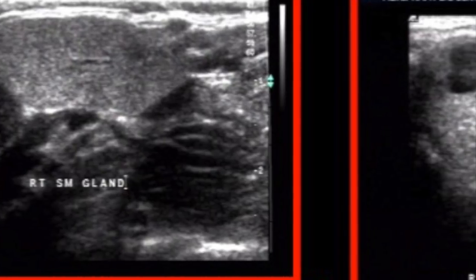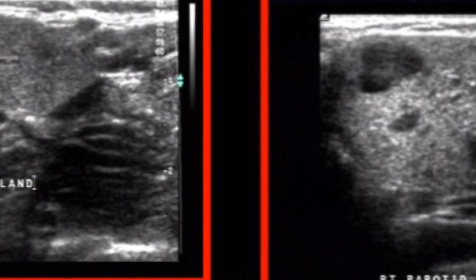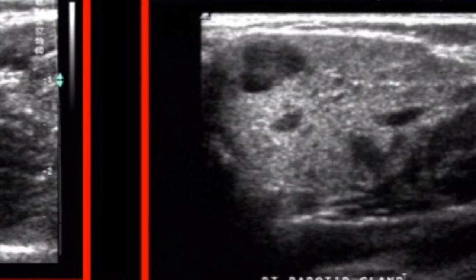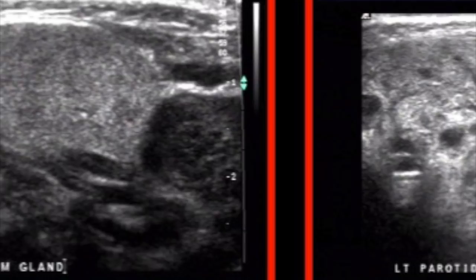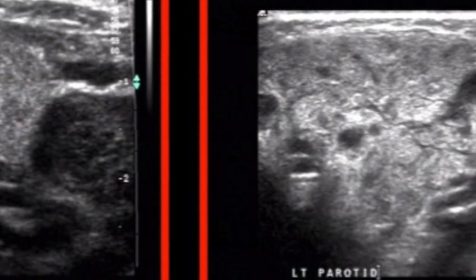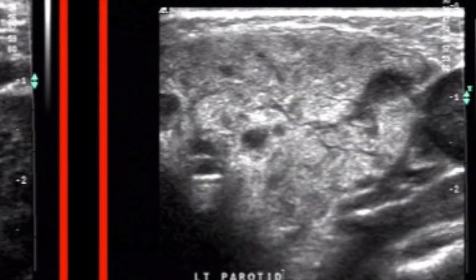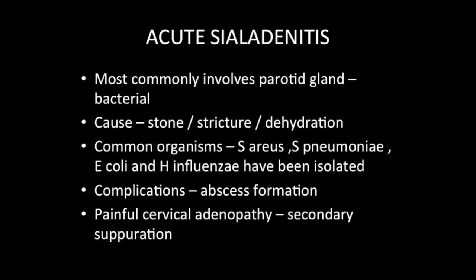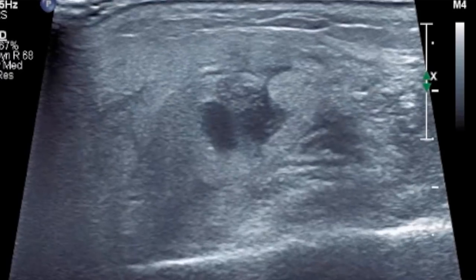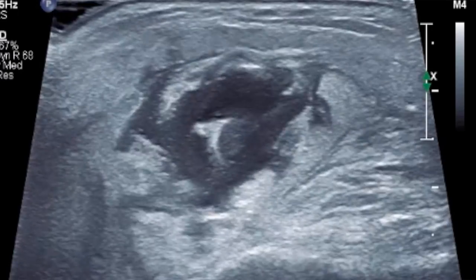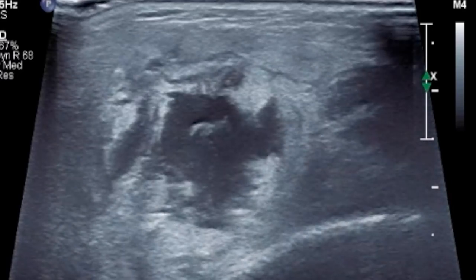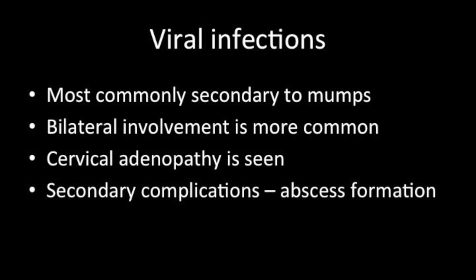The most commonly seen condition in day-to-day practice is sialadenitis. The patient presents with pain and swelling, the gland looks enlarged and heterogeneous, on Doppler it looks vascular, and there are typically level 2 and jugulodigastric nodes. With the appropriate clinical history, you write acute sialadenitis. Most commonly in practice we see parotid involvement in sialadenitis, which is most commonly bacterial. The causes and organisms are multifactorial, but what is more important is to always follow up cases of sialadenitis because they are prone to secondary complications like abscess formation and painful cervical nodes that may enlarge and suppurate. Always ask for a follow-up in all cases of sialadenitis.